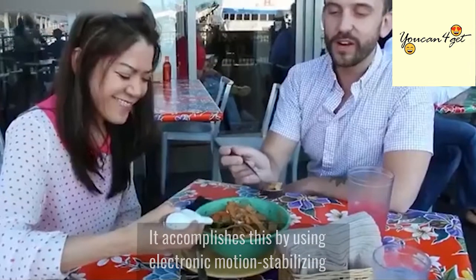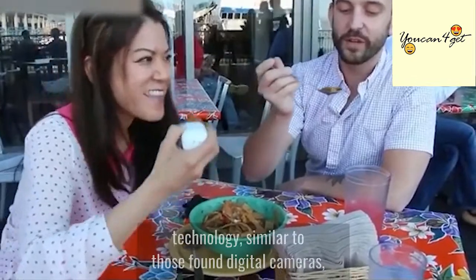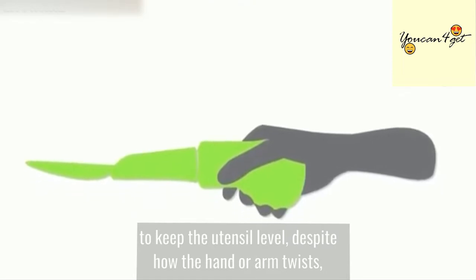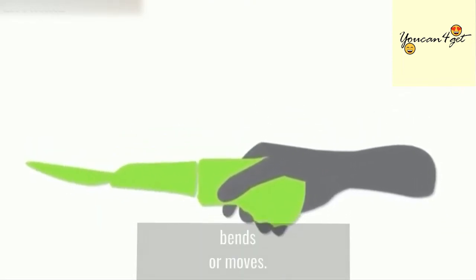It accomplishes this by using electronic motion stabilizing technology, similar to those found in digital cameras, to keep the utensil level, despite how the hand or arm twists, bends, or moves.